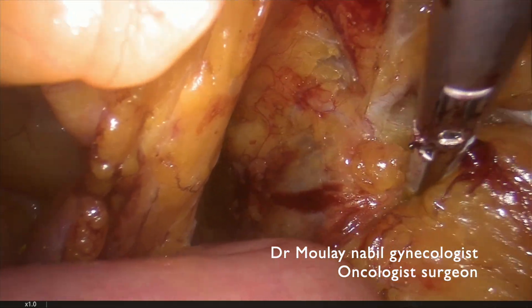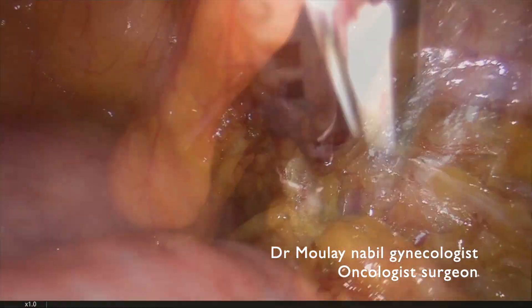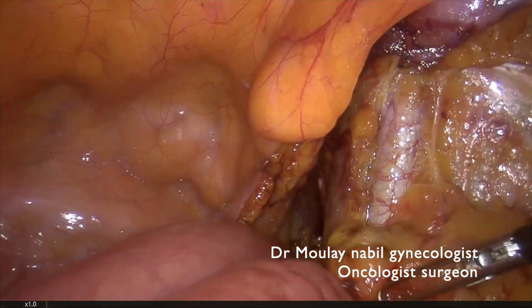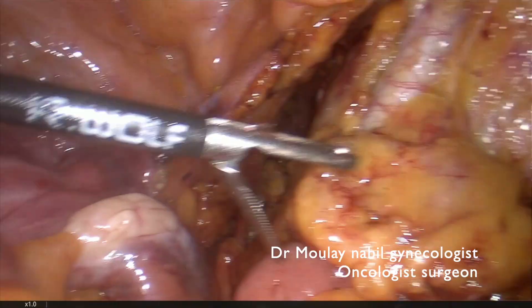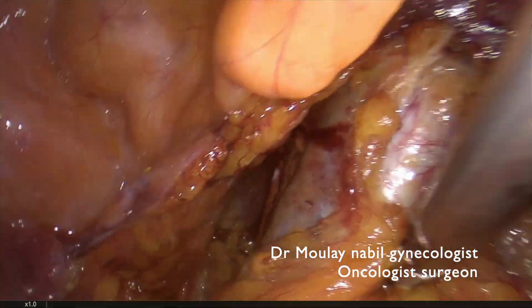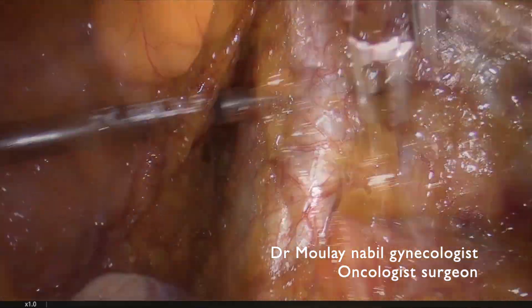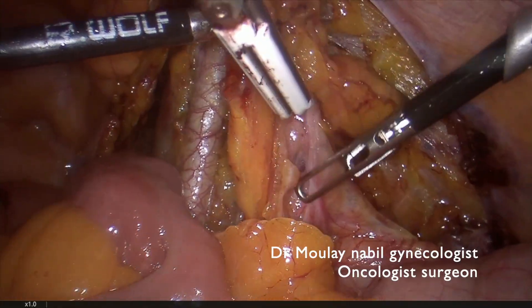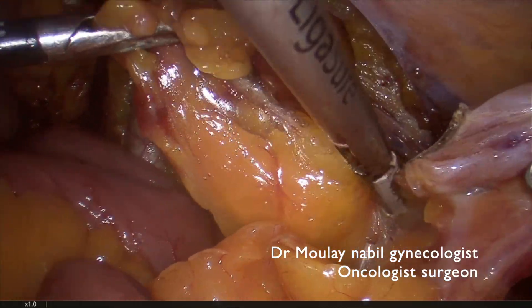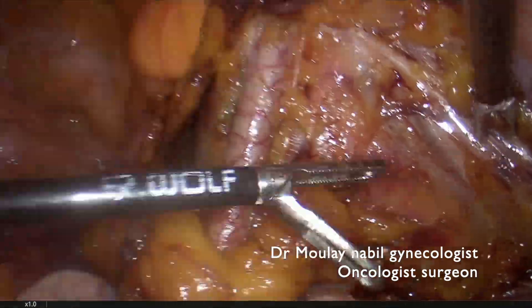It's really important to work slowly in the fatty patient to decrease the risk of lymphatic hemorrhage and to decrease the risk of post-operative lymphocele, particularly if you have metastatic nodes. It's important as well that you preserve the genitofemoral nerve. So this node is firstly removed.